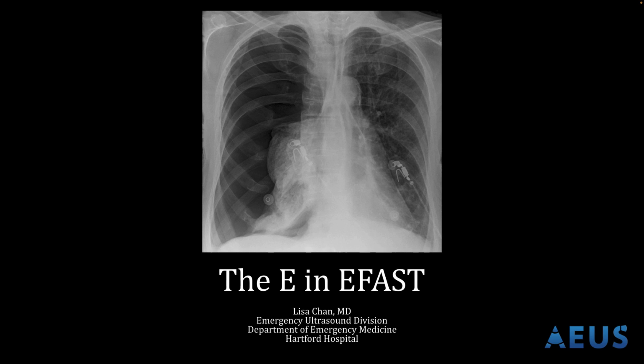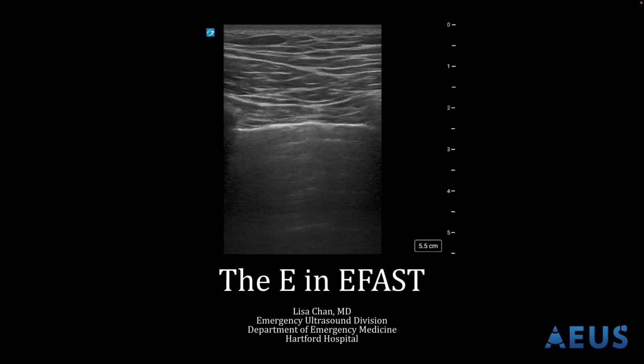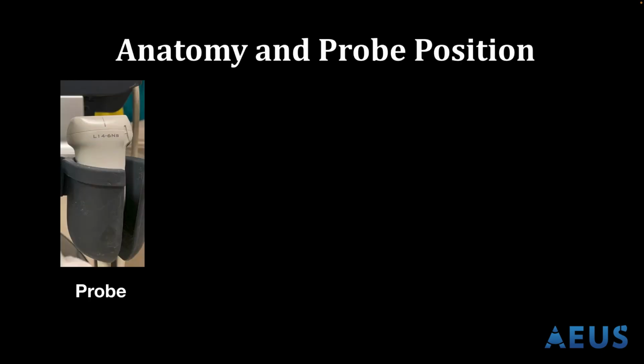Several studies have shown that ultrasound has greater sensitivity than chest X-ray for detecting pneumothorax in supine patients. For example, a meta-analysis conducted in 2020 found that lung ultrasound had a sensitivity of 91% as compared to chest X-ray with a lower sensitivity of 44%. With that being said, let's use ultrasound for pneumothorax. First, let's talk about the setup.